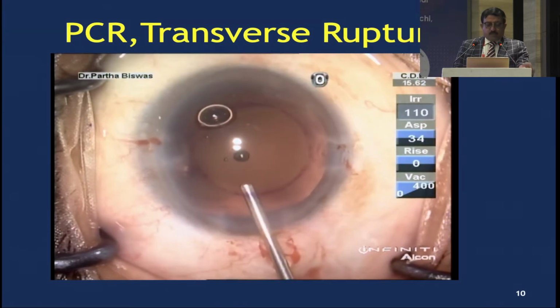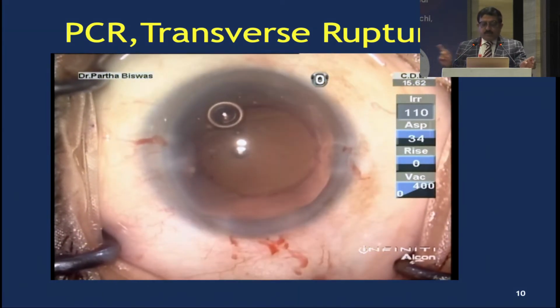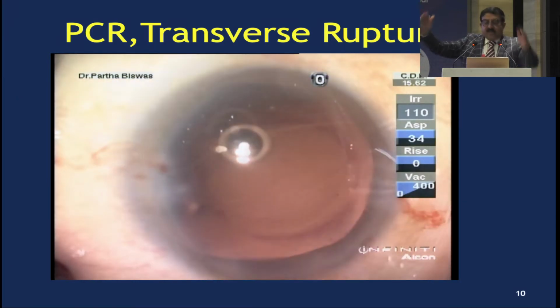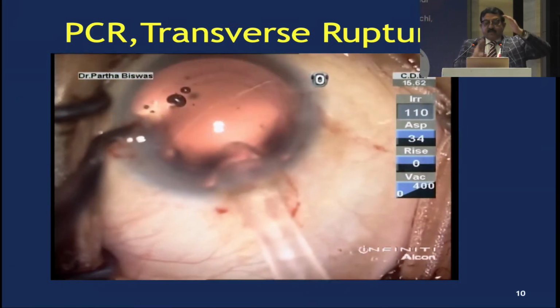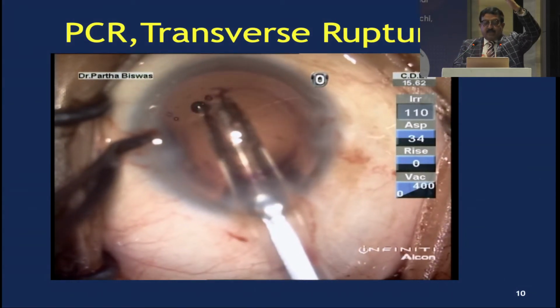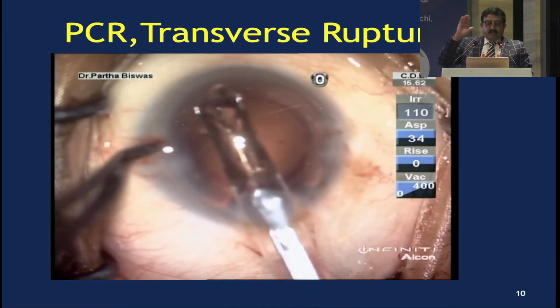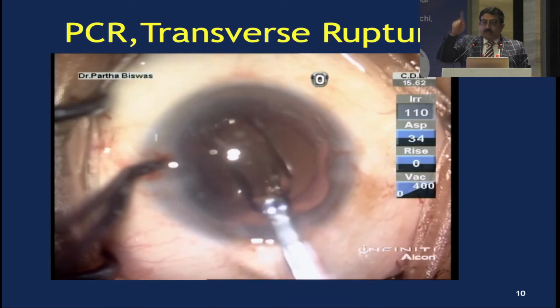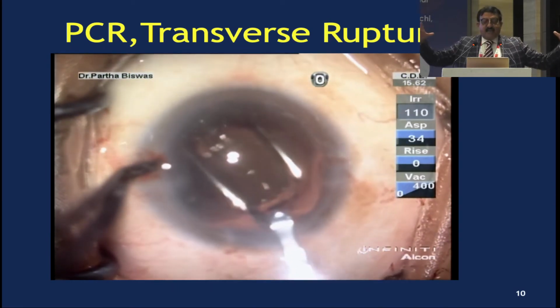So this is not for all cases again. Here no vitreous has come, we have a PC rupture, and you can see that's a large PC rupture there, like a hammock. But there we have opened out the posterior capsule from the anterior capsule, and now we are landing the leading haptic over the iris. Very important, over the iris, and the iris should be nicely stretched out.